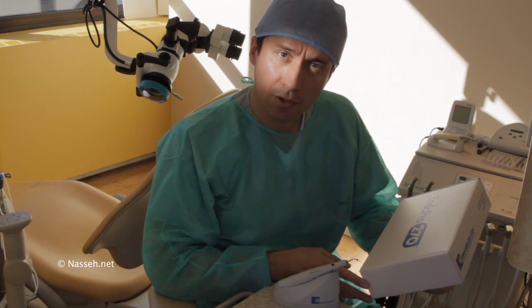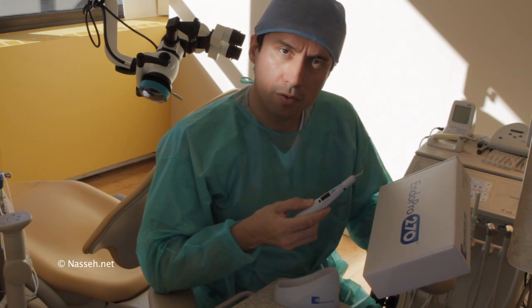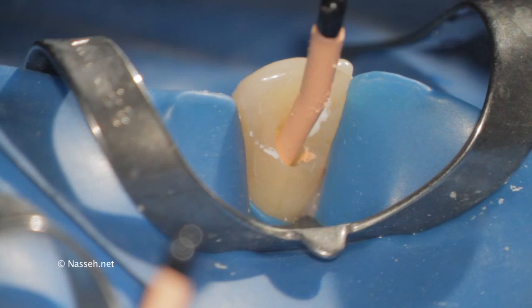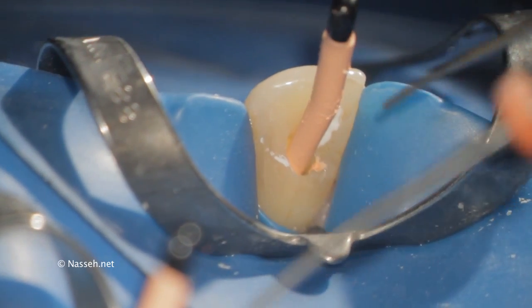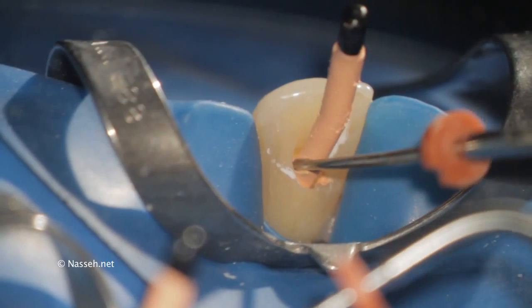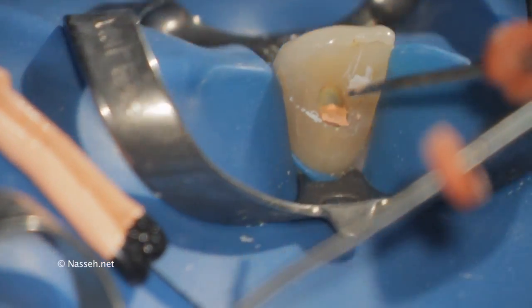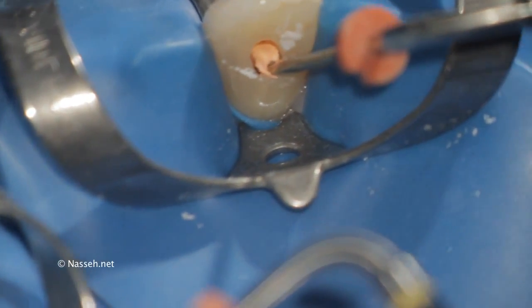Hello everybody, I'm Alan and I'd like to share with you a new product by Brassler USA, the Endo Pro 270. Wouldn't it be nice if we could simply sear off the gutta percha and condense it down and call it a day? Well, the Endo Pro 270 cordless handpiece allows us to reach a higher temperature, which makes searing off of the gutta percha much easier.